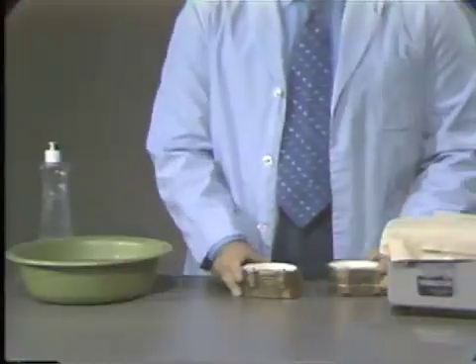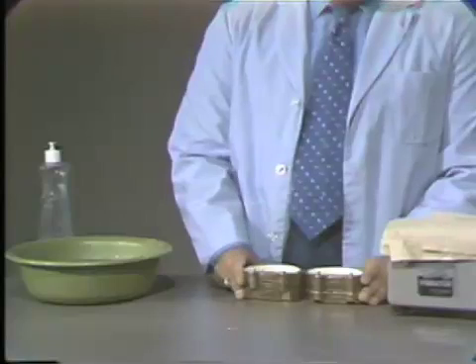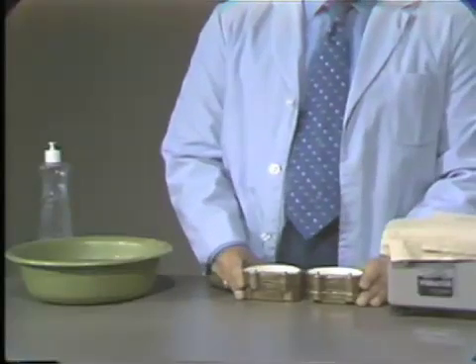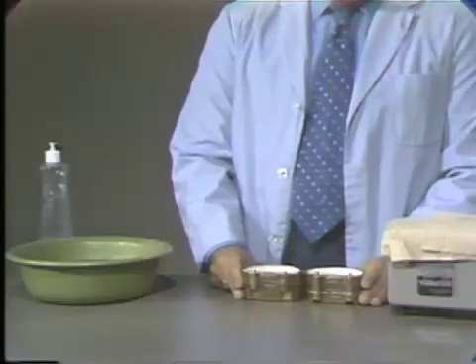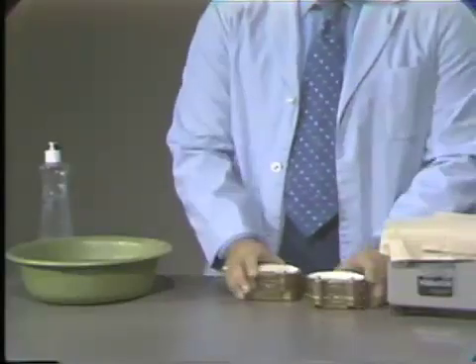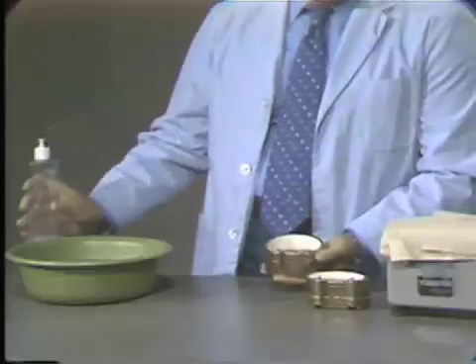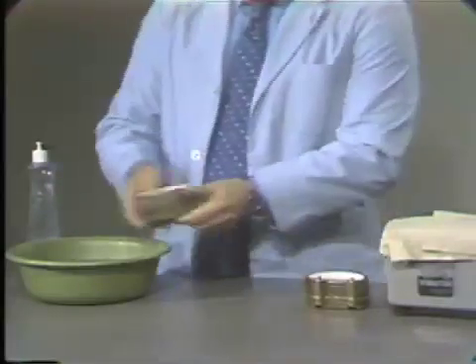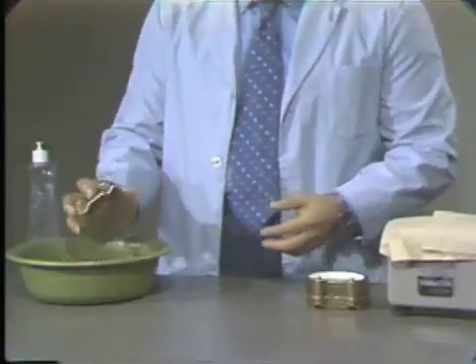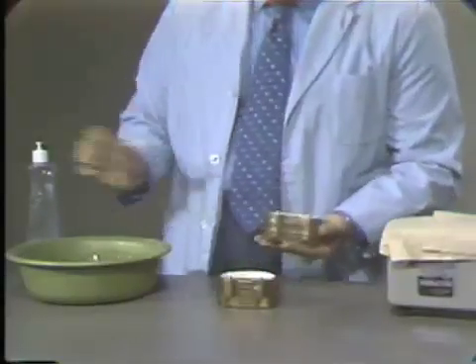With the third pour of our denture, we will be using dental stone or yellow stone, because for the last pour we want high strength so that the teeth do not move during the molding procedures. Prior to doing this, we will again put red soap on the stone, just a small amount, spread it around and rinse it off. This acts as a separating media for the last pour.